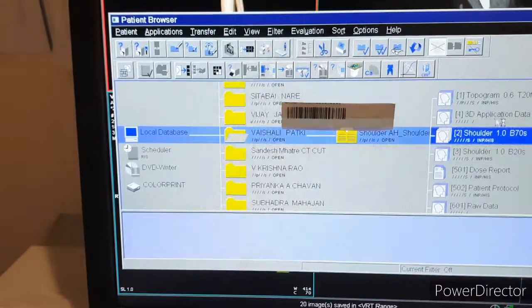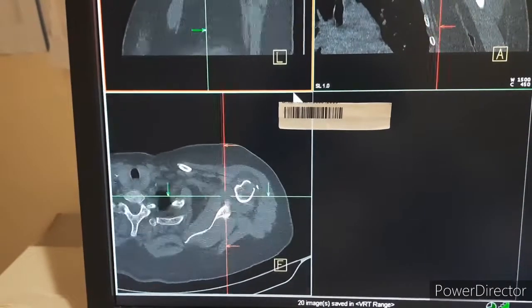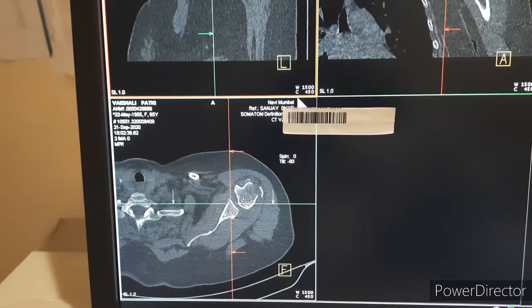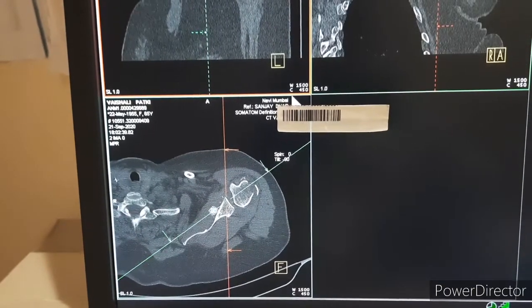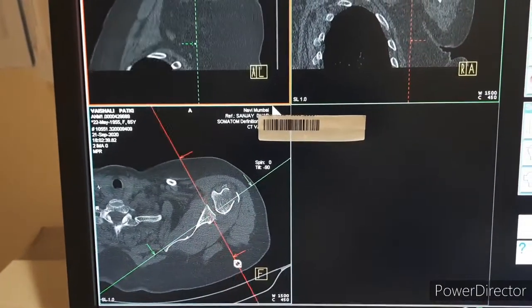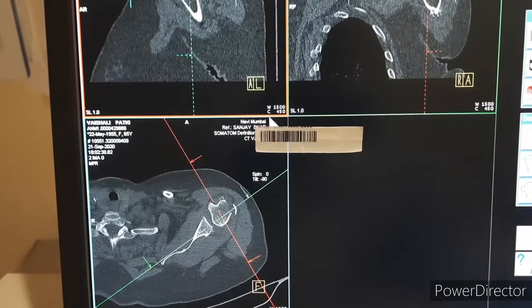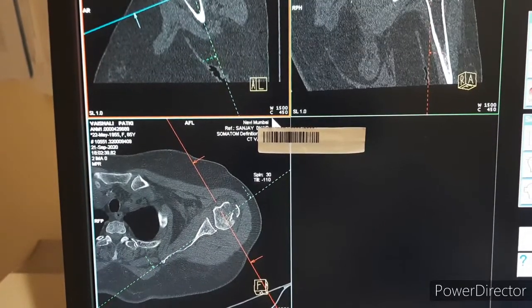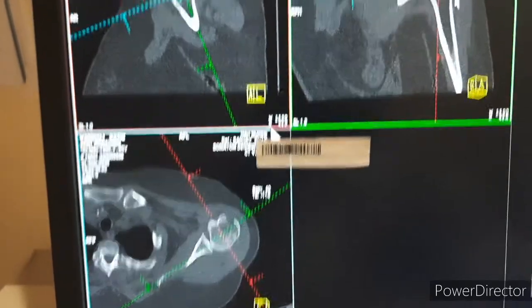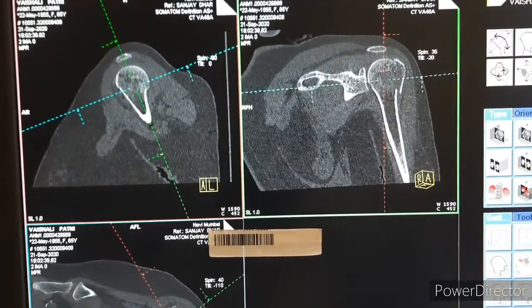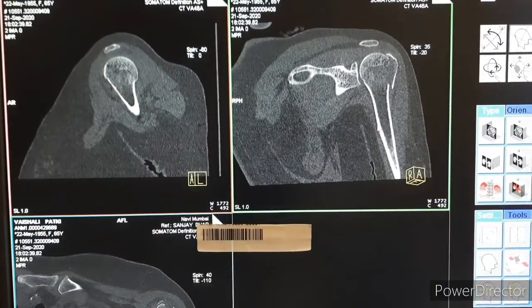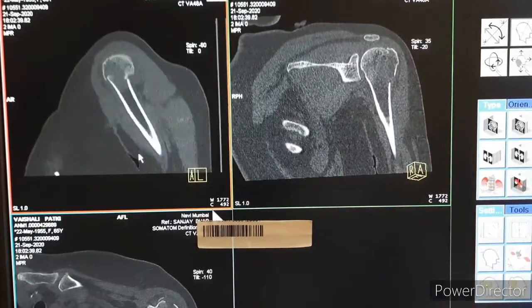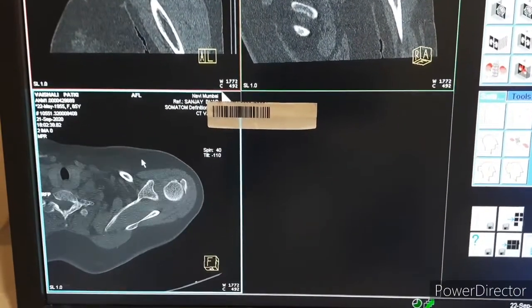For the MPR section, go to the refresh section. You can make coronal, sagittal, and axial reconstructions as per your filming format.